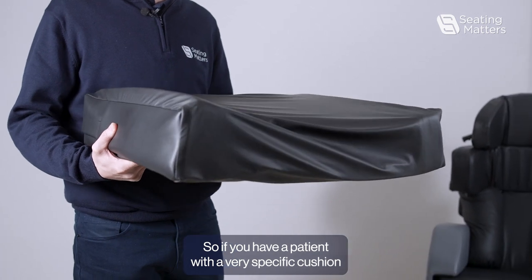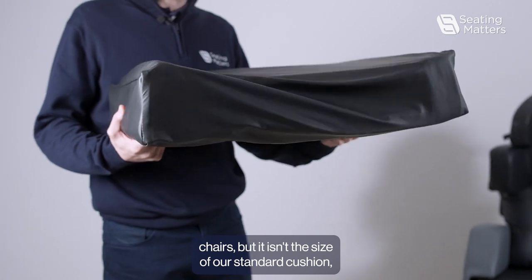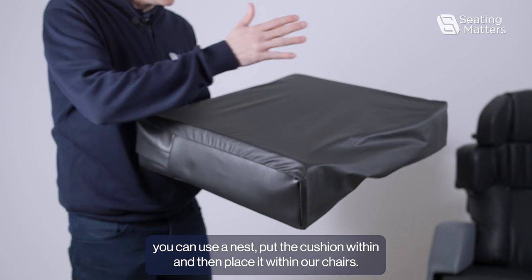If you have a patient with a very specific cushion and you want to use it within our Seating Matters chairs, but it isn't the size of our standard cushion, you can use a Nest, put the cushion within, and then place it within our chairs.